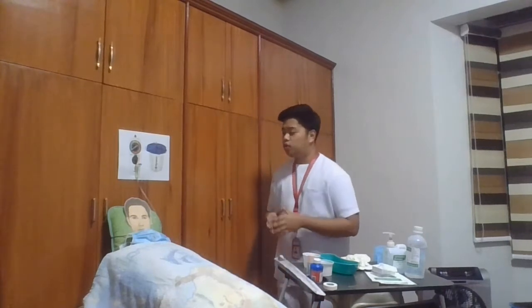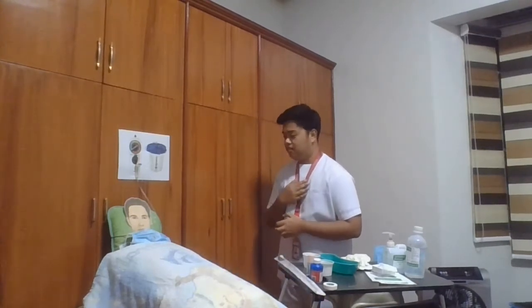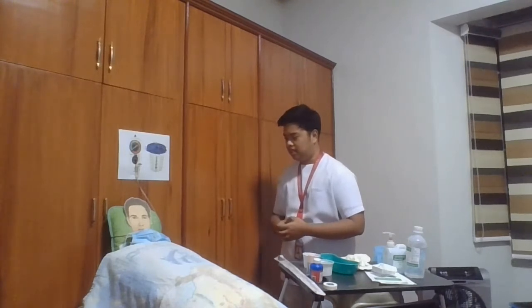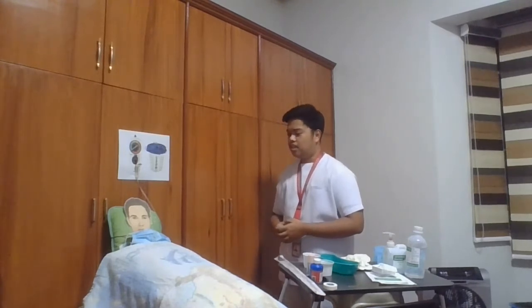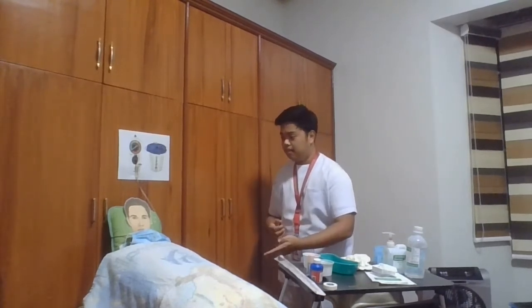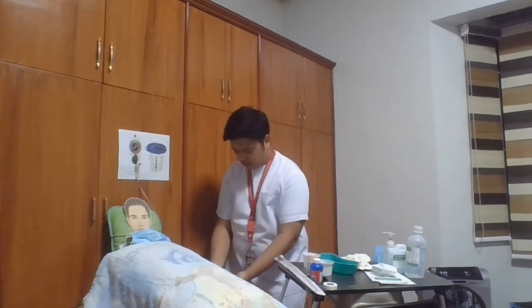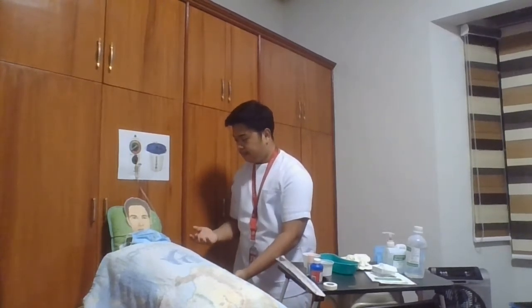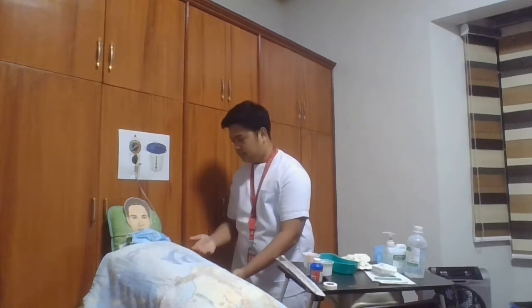The first thing we will do is identify the client by checking his ID band, and then we're going to ask him to state his name and birth date. Good day sir, my name is Mars Miguel Sivis-Monte and I am a third-year nursing student from San Veda University. Is it okay if I check your ID band? Sir, may I ask you to state your name as well as your birth date?